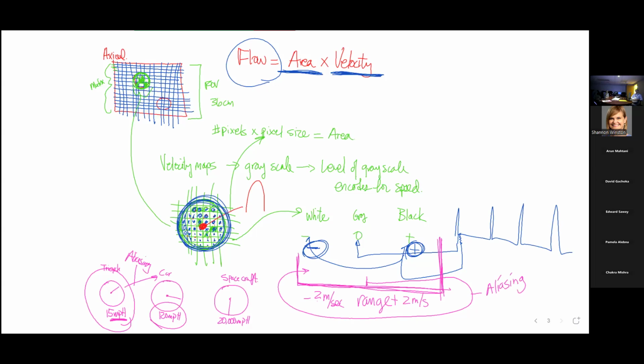Okay? Because the car is going 120 miles an hour, and this speedometer is just going to go, wee, right? You're going to wrap it around a gazillion times. So this speedometer does not work on this car.